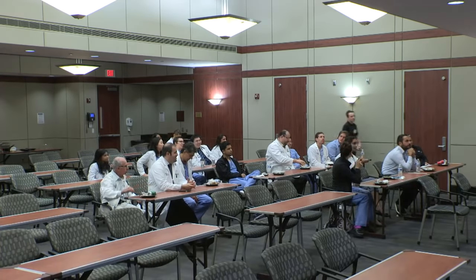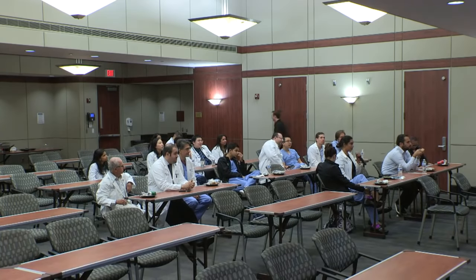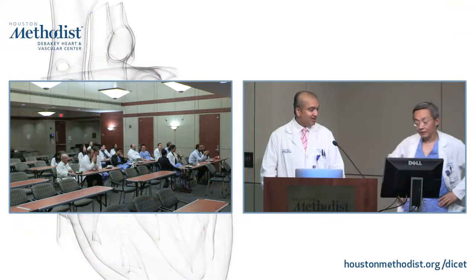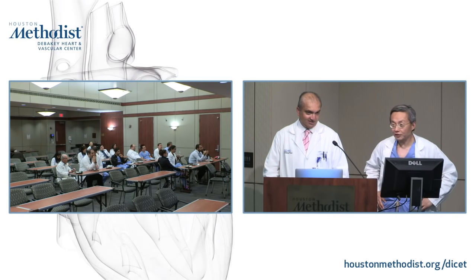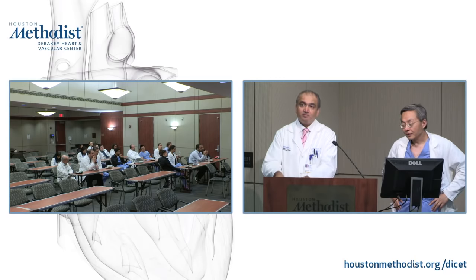If after doing a TEE, somebody's still not comfortable ruling out endocarditis, would it be recommended to repeat a TEE in a little bit or do a CT or CMR? Okay. And we get that quite often in terms of referrals. I think it depends. On the mitral valve, it is very unusual that you cannot have a diagnosis unless you have a lot of artifacts. Aortic valve is a little bit different. If you don't see it with a reasonably good quality TEE, the vegetation is probably not very big.